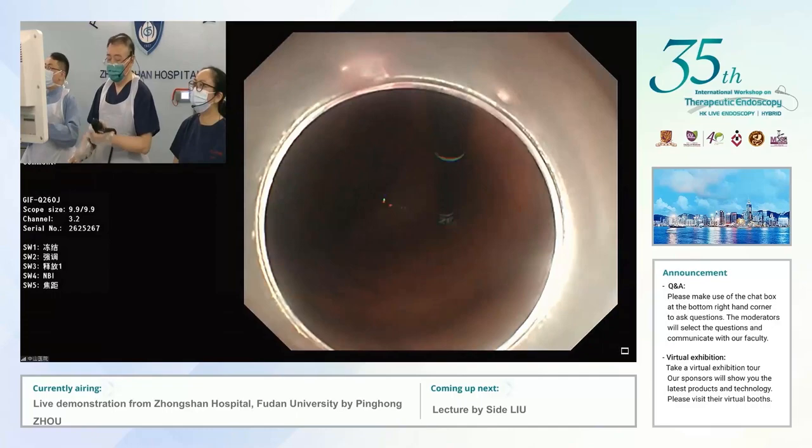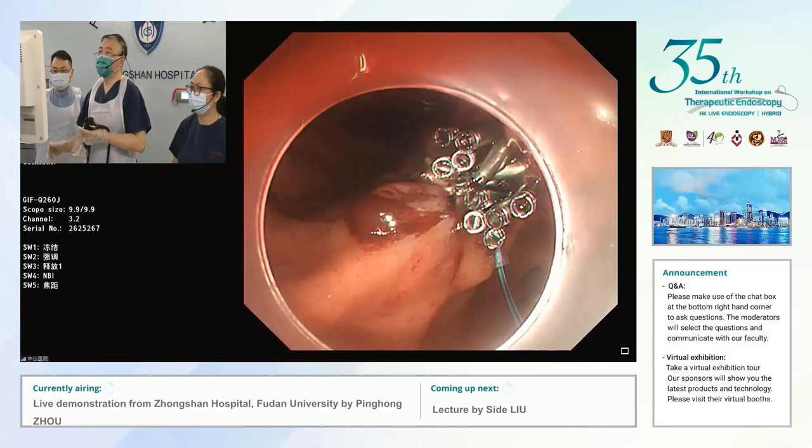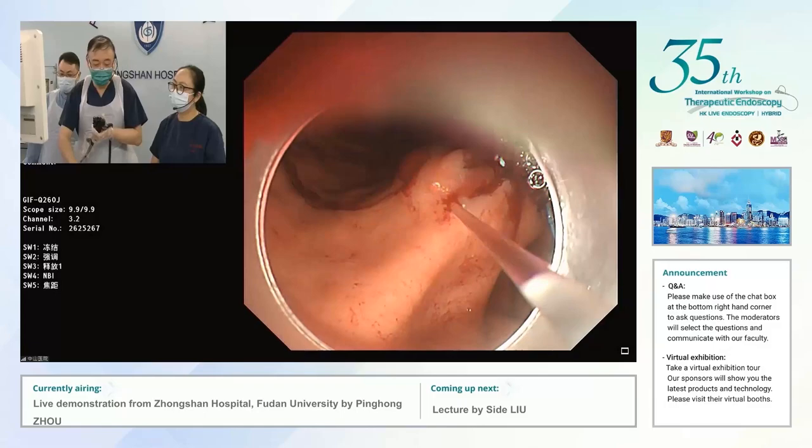Are you happy that there's no gap? There are still some small areas. Sometimes after the suture we spread some fibrin glue to fill the gaps. For this case I think there was no air in the abdominal cavity.